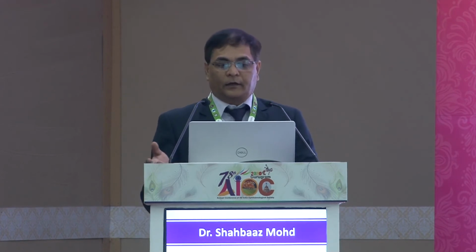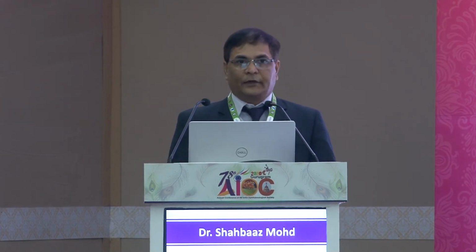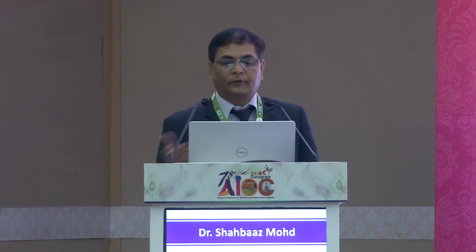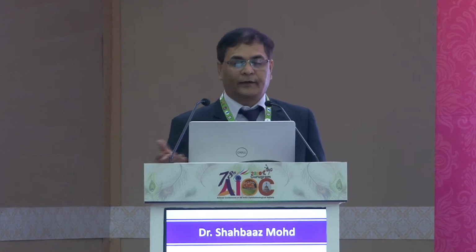Now coming to the immersion. Immersion is superior to the contact method because it does not touch the cornea. So you do not get that 0.2 millimeter shortening; a lot of studies have shown that shortening occurs in the contact method. The patient is supine or in a reclining chair.